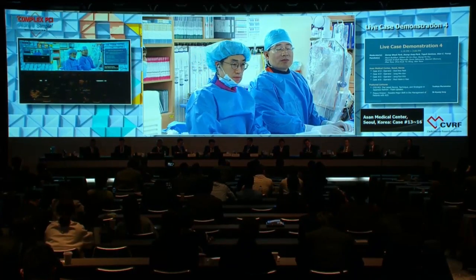And secondly, we have seen a very nice demonstration, in the first case particularly, of co-registration of OCT and coronary angio. With this co-registration, we can very precisely define where the region of interest is. And I think in the very near future, we may be able to use QFR also, which may enable us to assess, at the same time, QFR, so flow, as well as the anatomy. Of course, we need studies to validate this. Thank you. Dr. Kim?